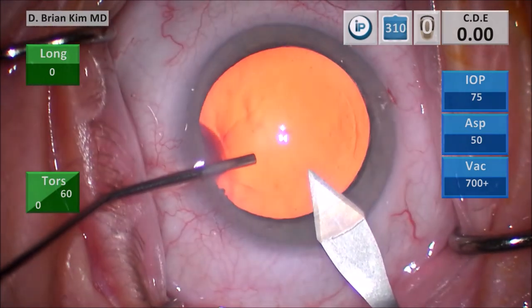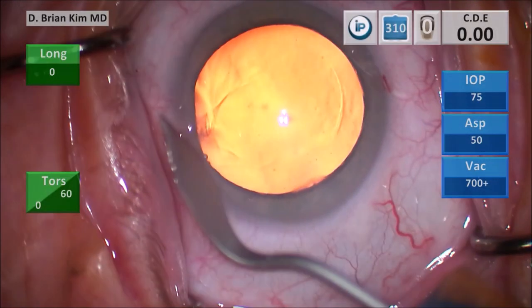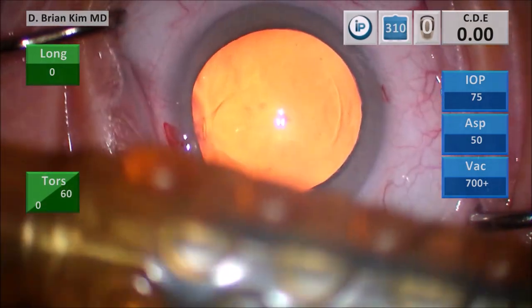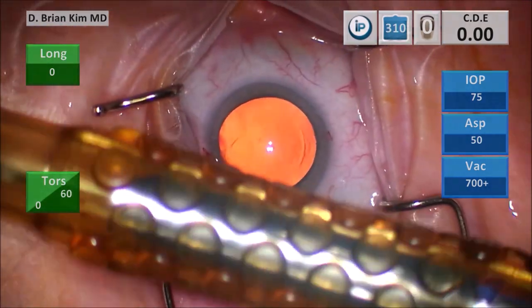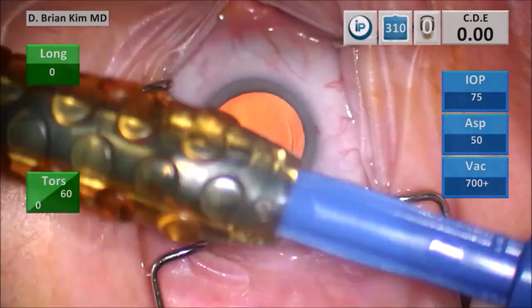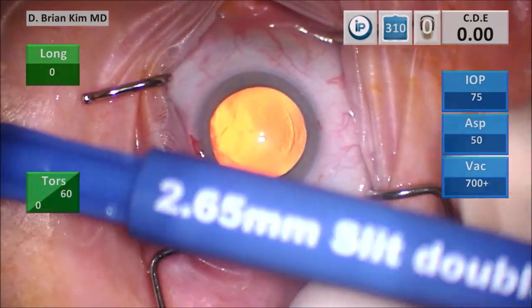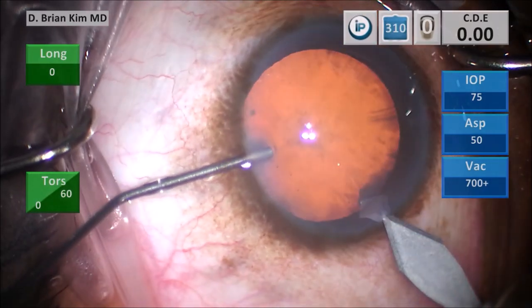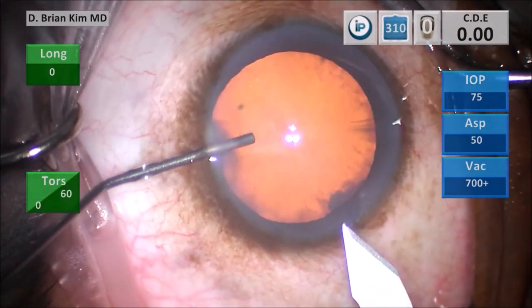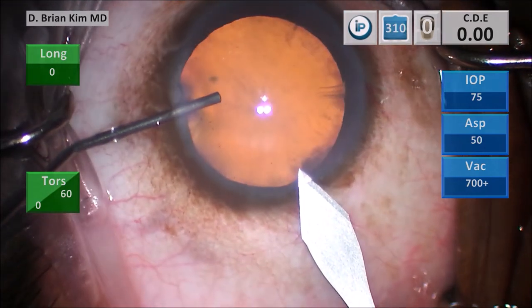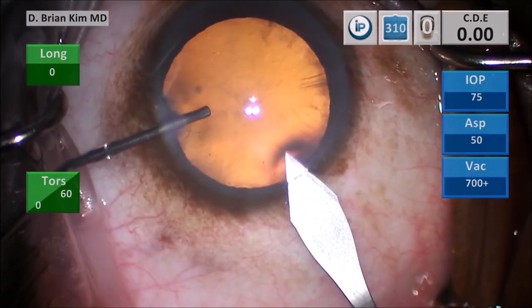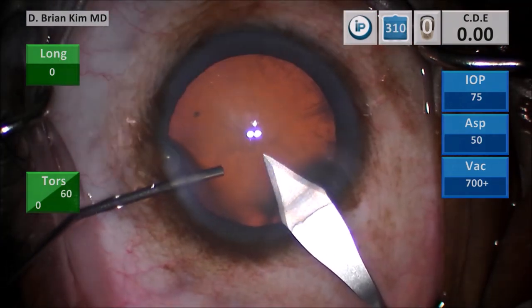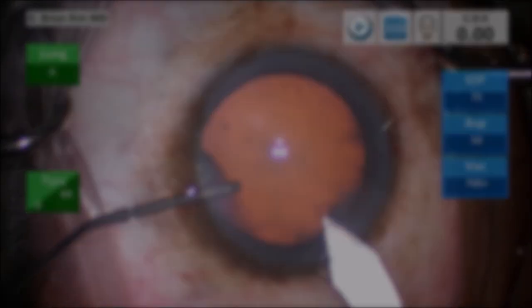As you can see at the end of the case, I'm able to pull the sleeve down, which covers the blade, and so this is a safety mechanism for when you hand off the blade to your surgical technician. Again, this is a 2.65 double bevel blade. This is another case—I'm making a vertical groove, I'm stabbing, and then I'm tunneling, tunneling, tunneling, and then I'm going to go heel up, and then I'm going to carefully stab through, penetrate. That's my last portion of the triplanar corneal incision, and then I go all the way in.